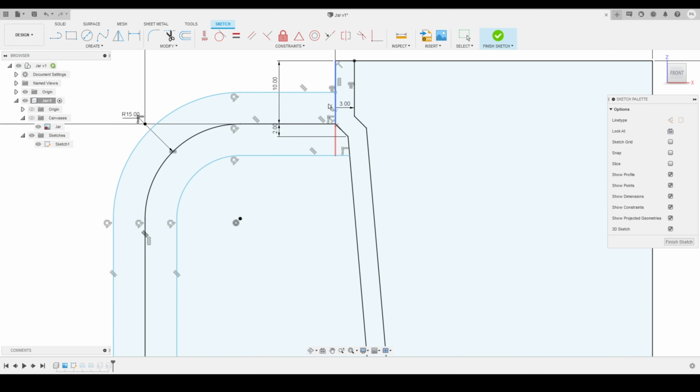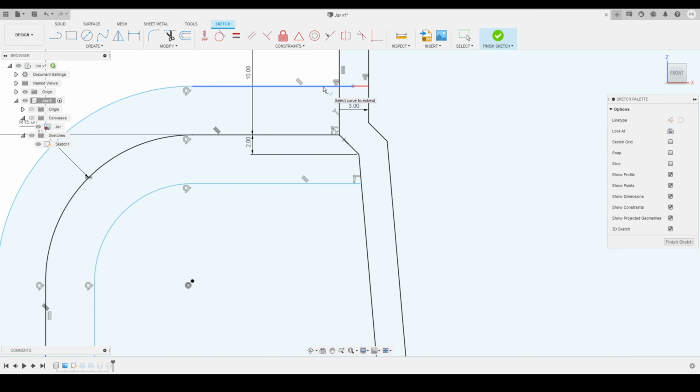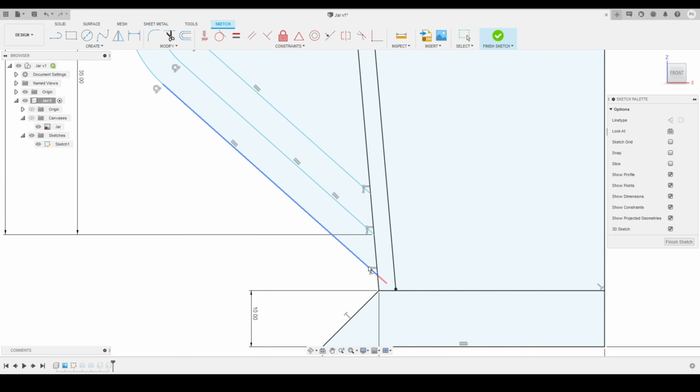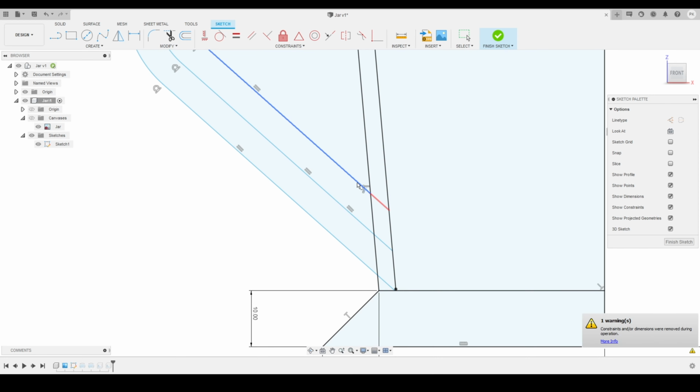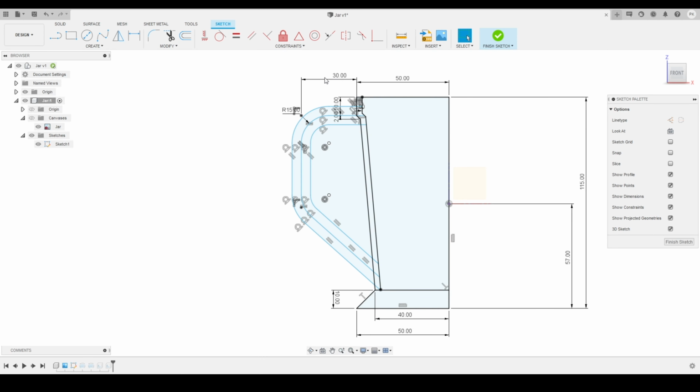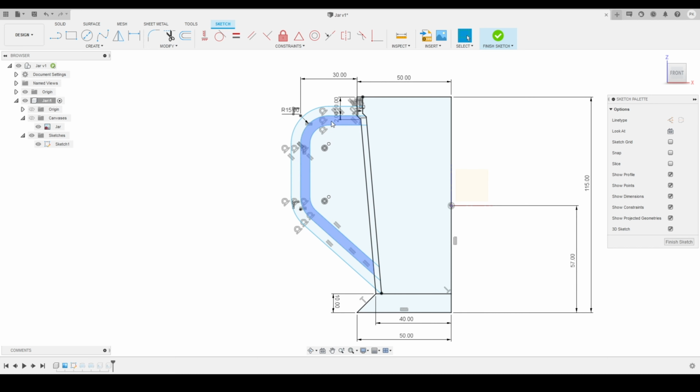Now I will again activate my extend tool and extend the handle profiles up to that face, up to that edge. And the reason I am doing this is because I will show you once I extrude these profiles. So you will get the reason why I'm extending this up to the inward position, up to this inside profile. So I will just carefully extend all the profiles up to that face, and once I am done with that, I can just click on finish the sketch.